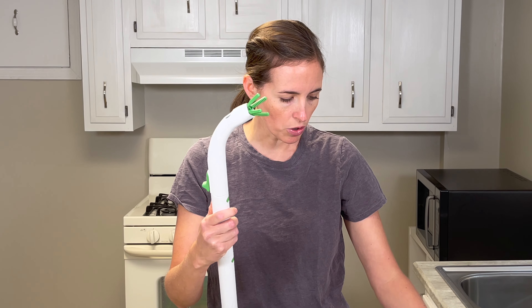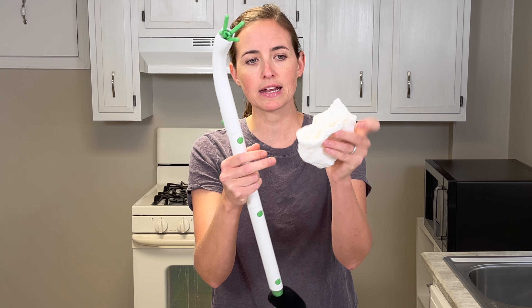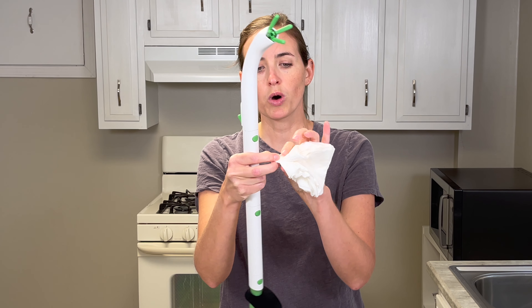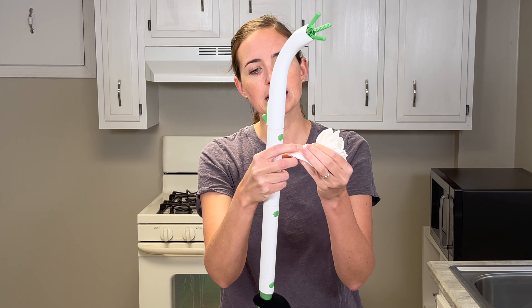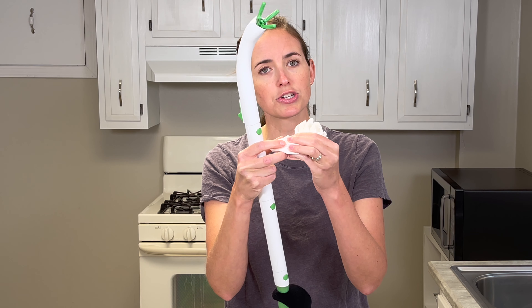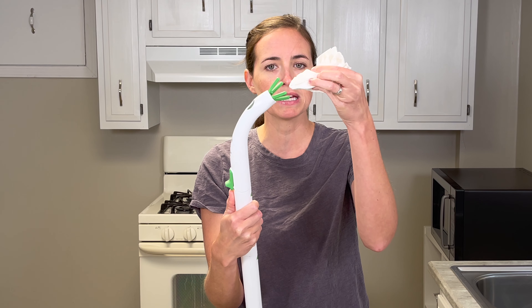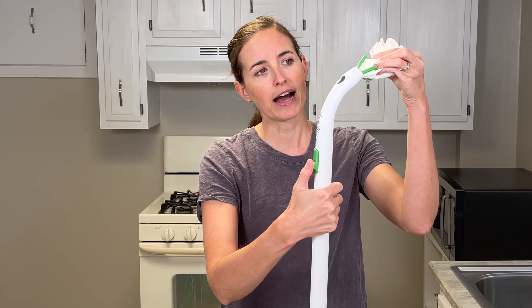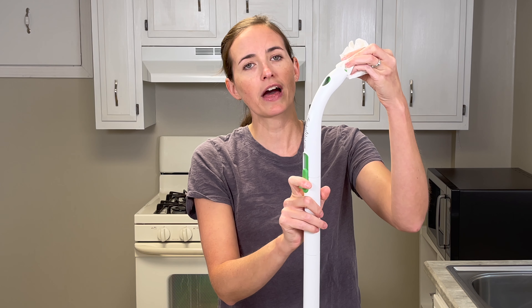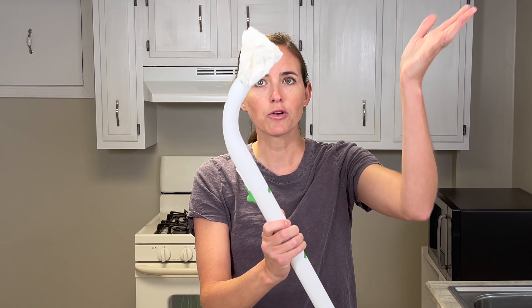The toilet paper needs to be prepared like this: four squares folded in half twice to create a single square of good ply. Then take the bottom and create a point. Deb actually recommends pre-making a bunch of these and keeping them in a bag next to your toilet. One way to do that is to apply a small rubber band — like tiny hair tie rubber bands — to the bottom so it's ready to be inserted deep inside the little fingers. Push down, pull that down into the mechanism, and to test it, hold it and pull — if it doesn't fall out, you're good to go.